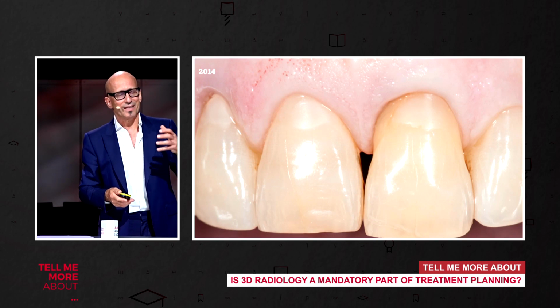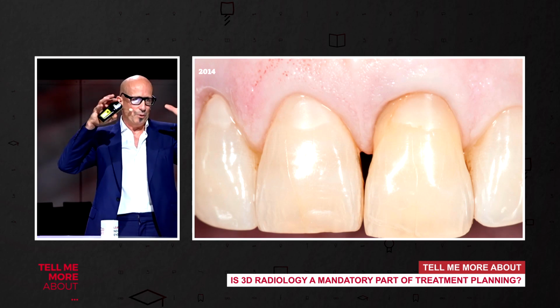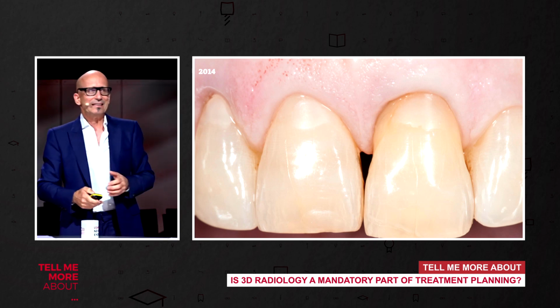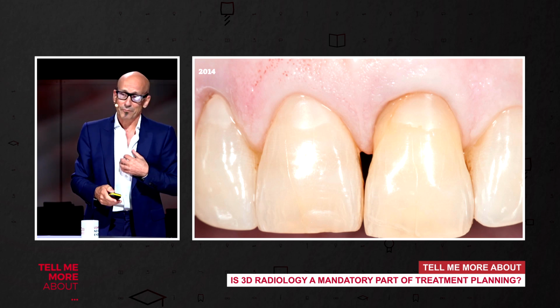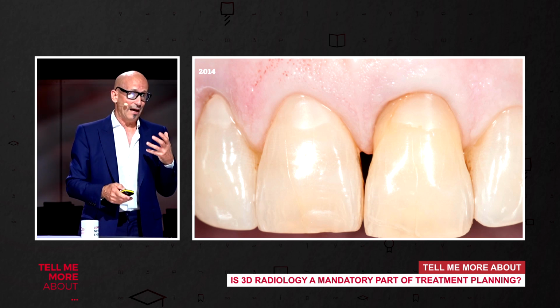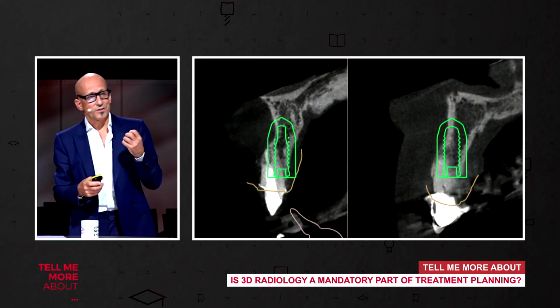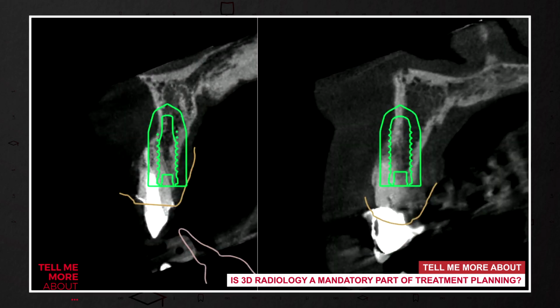To place an implant immediately into an extraction socket in the aesthetic zone without knowing the bony structure, which we will see later on when the tooth is out, this is today, in my opinion, something where we have to think about, and using the 3D analysis is mandatory. Here, for instance, we extract the tooth, and in the analysis, most of the time, our CBCT looks like this. And we see the tooth is completely in a different position than where we are going to place our implant.